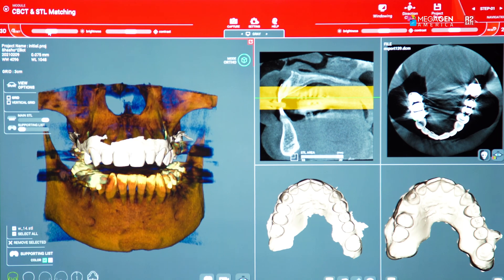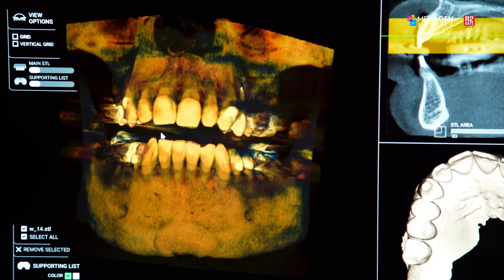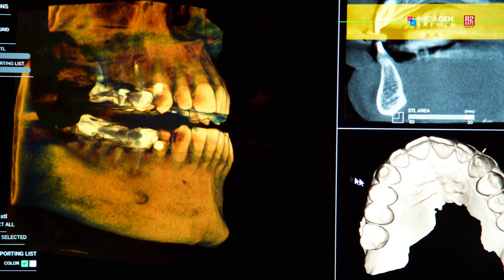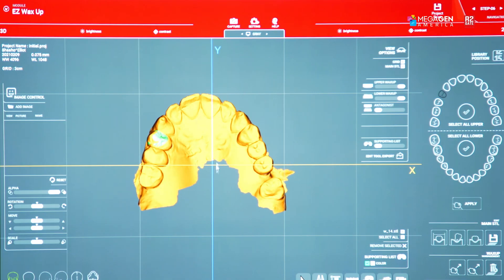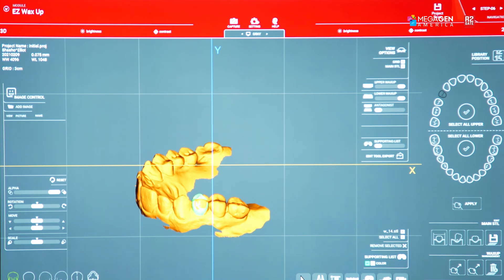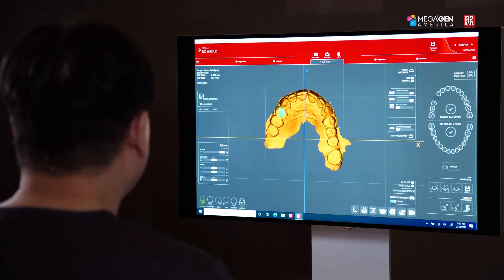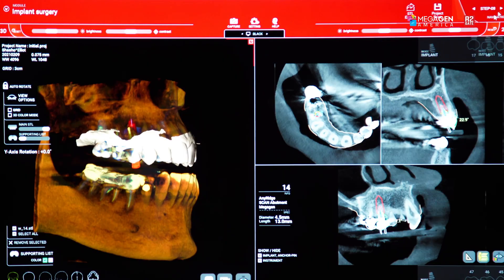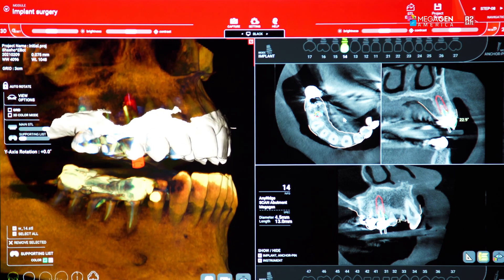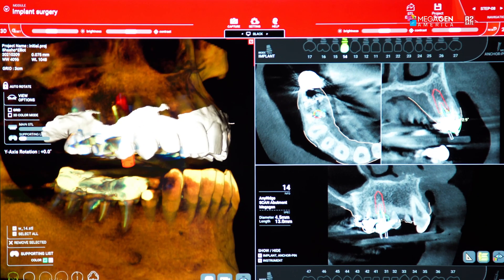Dr. Isaac Towel sent us intraoral scan data using the Medit i700 intraoral scanner. R2-GATE is famous for the most accurate positioning of intraoral scan data into CT scan data. Using the R2-GATE software, we virtually removed and extracted tooth number five. Then on the extraction model we did the diagnostic wax-up using the program called Easy Wax-Up — it takes about five minutes to do an anatomic wax-up and it's very easy to learn. Based on this wax-up we can do the implant surgical planning, positioning the AnyRidge implant 4.5 by 13 millimeter in length at the palatal root. There will be some fragment of tooth number five on the buccal area.